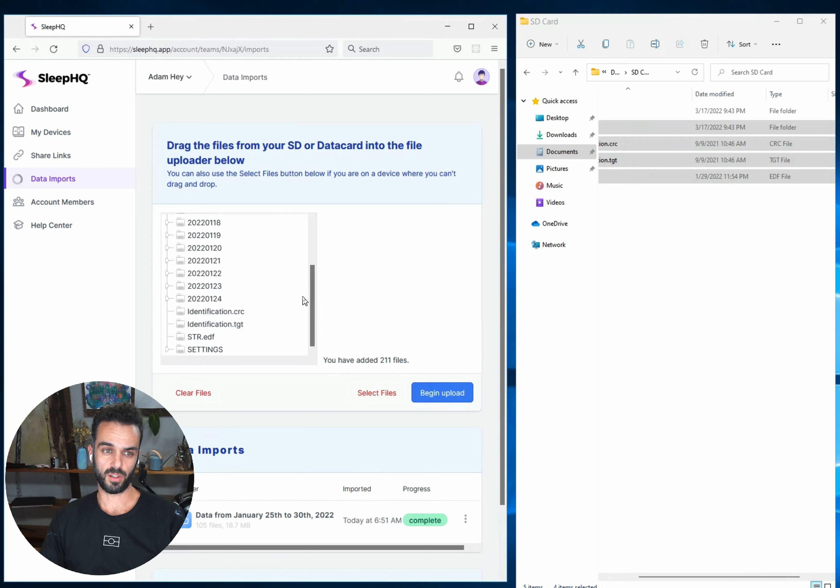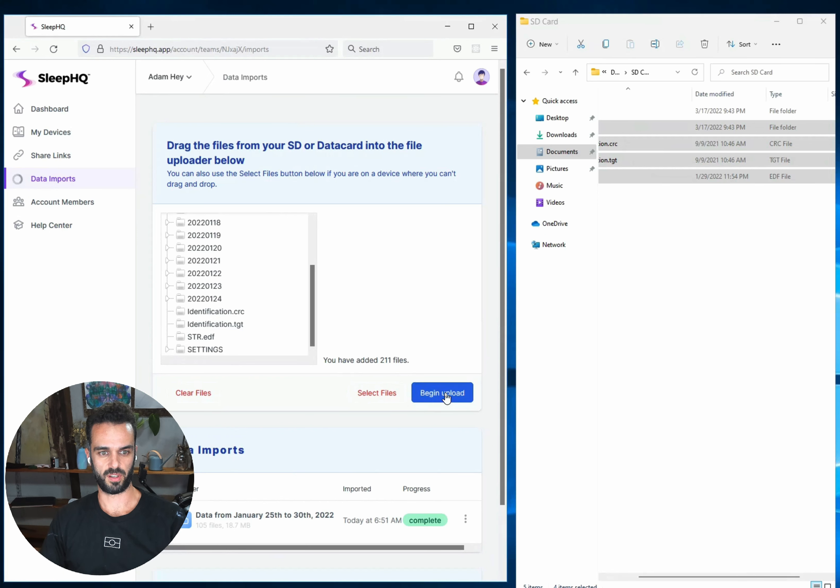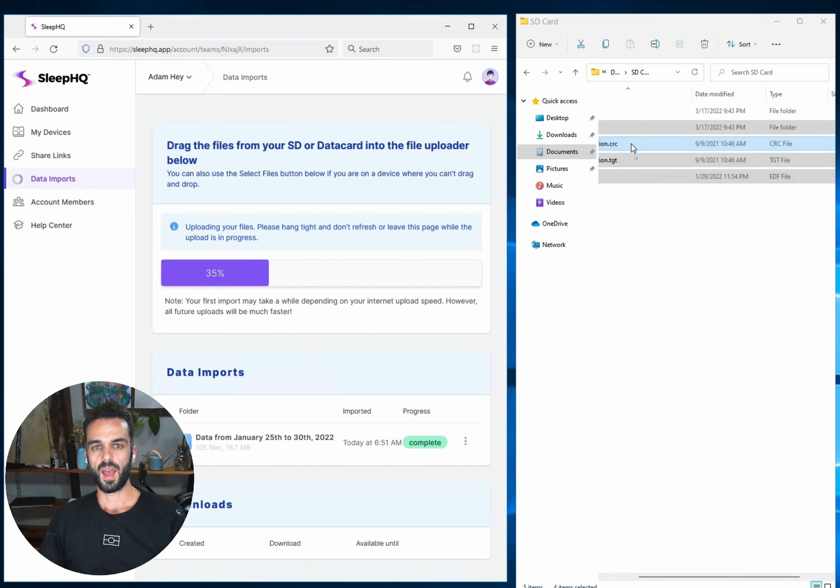They might look slightly different depending on which machine you're using, but whatever is in that top level folder that's not the Datalog, that's the files that you need to upload. So I'm now going to say begin upload on my second chunk of files. And so that's now going to process.